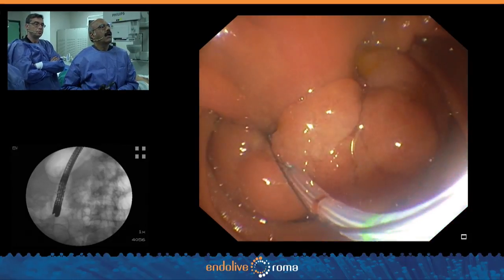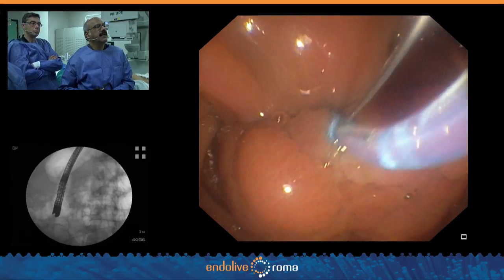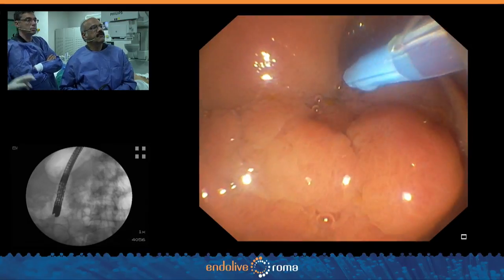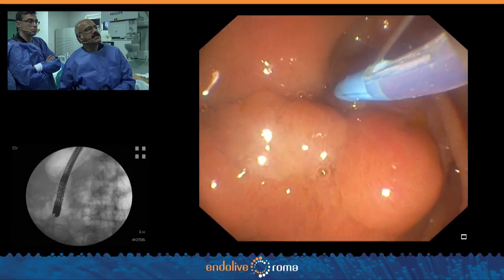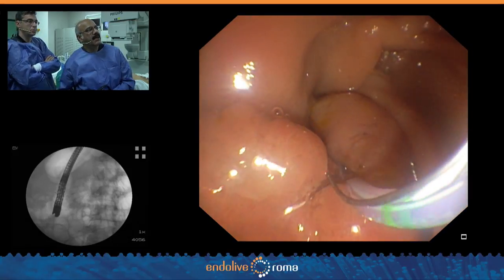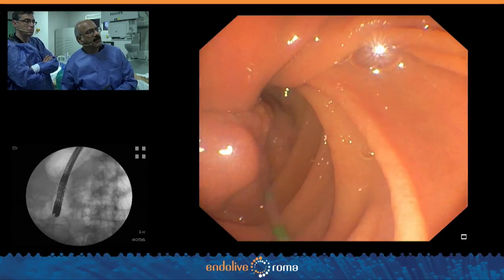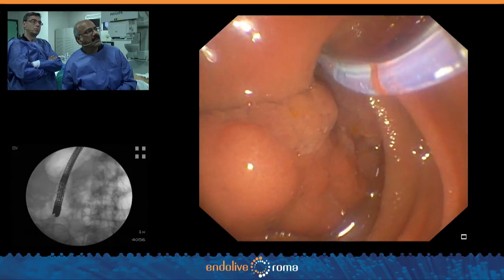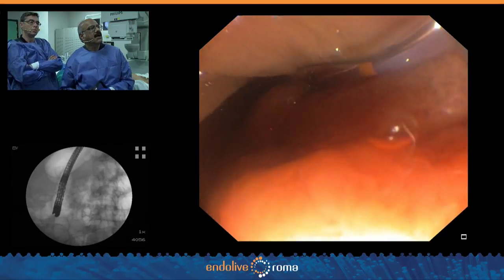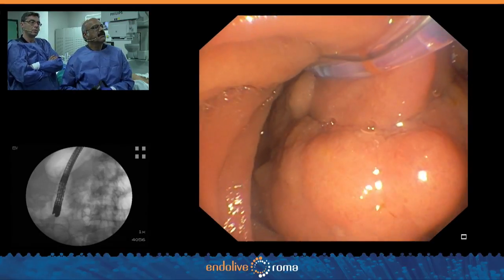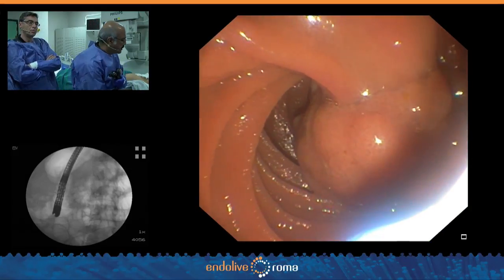Could we just approach the lesion and remove it? Yes, that's an option if you don't find the opening. But if you do find an opening and it's a peripapillary lesion not coming exactly from the ampulla, then you don't need to worry about stenting the pancreatic duct. The ampullary opening may actually be on the side here — some bile was visible. Also assessing the pedicle size, as it's difficult to get deep into this area from below.